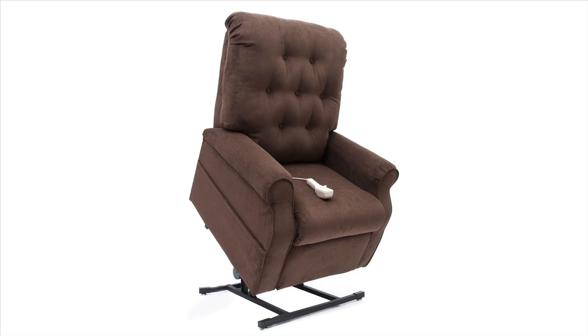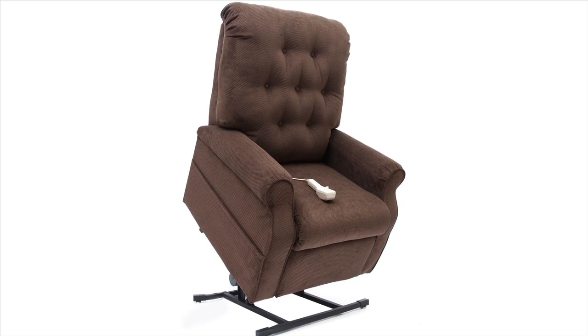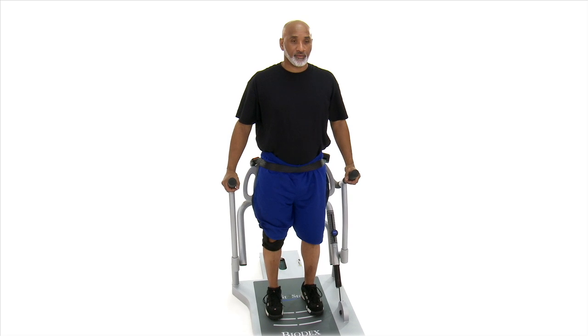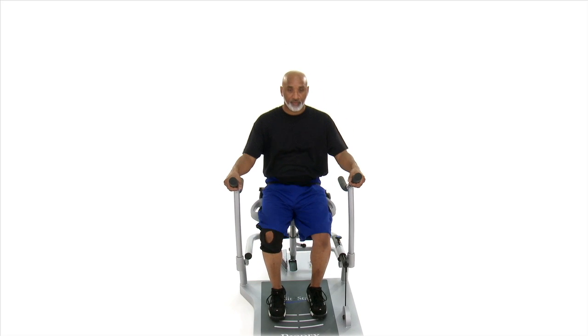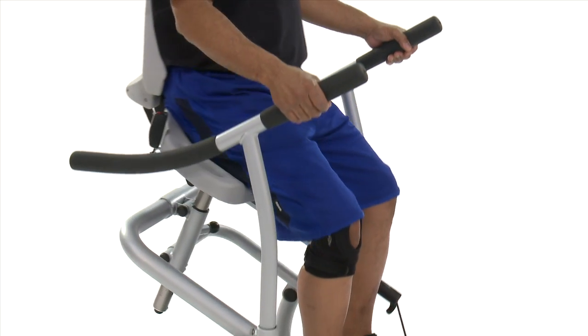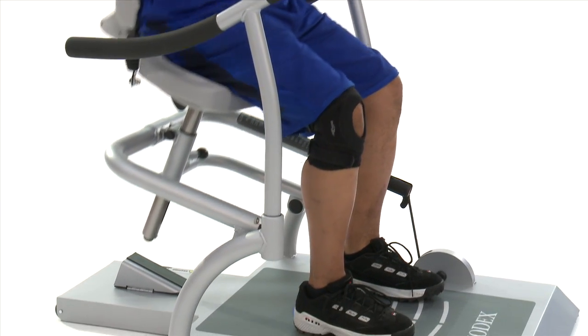Don't confuse this exercise device with a lift device used for rising from a chair. The Biodex sit-to-stand trainer is different — it is used to improve range of motion and increase strength, power, and the coordination of muscles associated with the sit-to-stand movement.